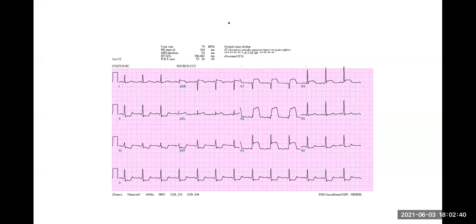Then we move on to the ST segment. And obviously, as an undergraduate and as a practicing doctor, the most important problem in the ST segment is ST elevation. At this stage in your final year, you should be able to spot ST elevations like this. But then you have to know the causes of ST elevations. The most important cause is, as you know, ST elevation myocardial infarction. But there are other causes also, and I would say pericarditis is the other one that you need to know.